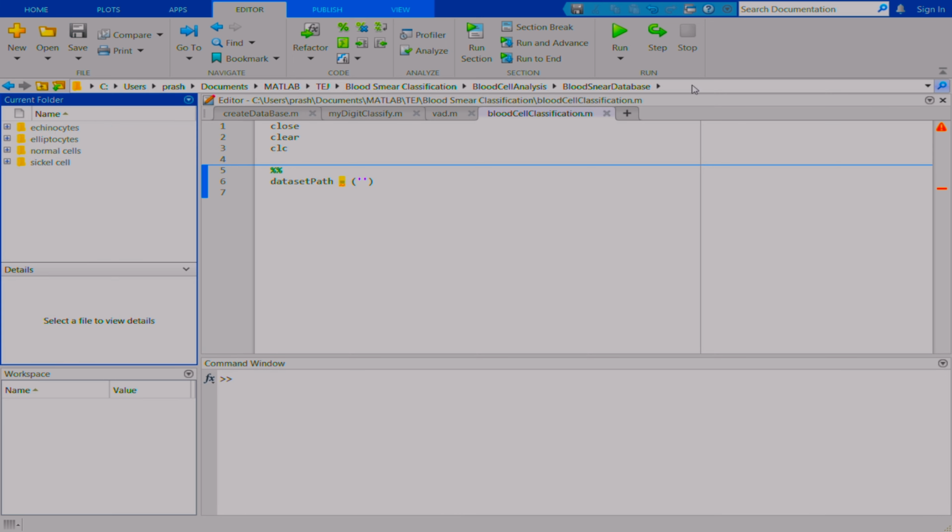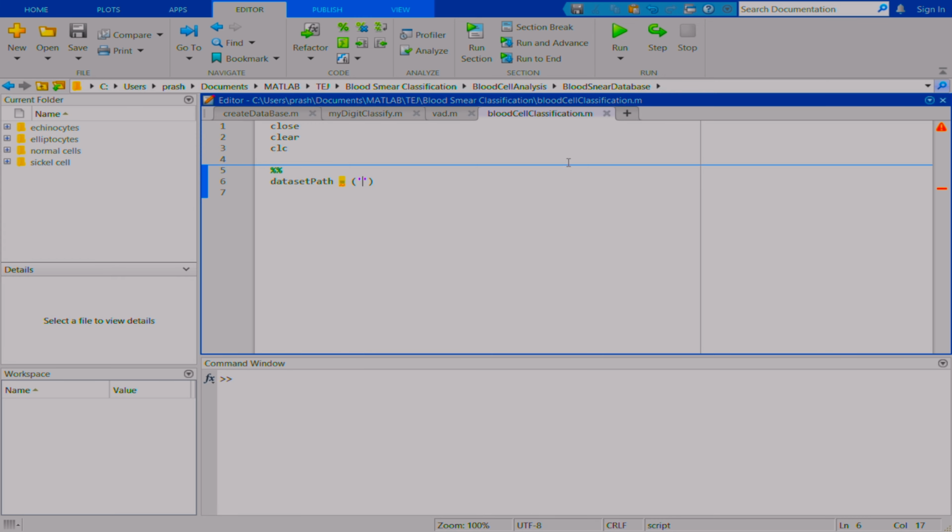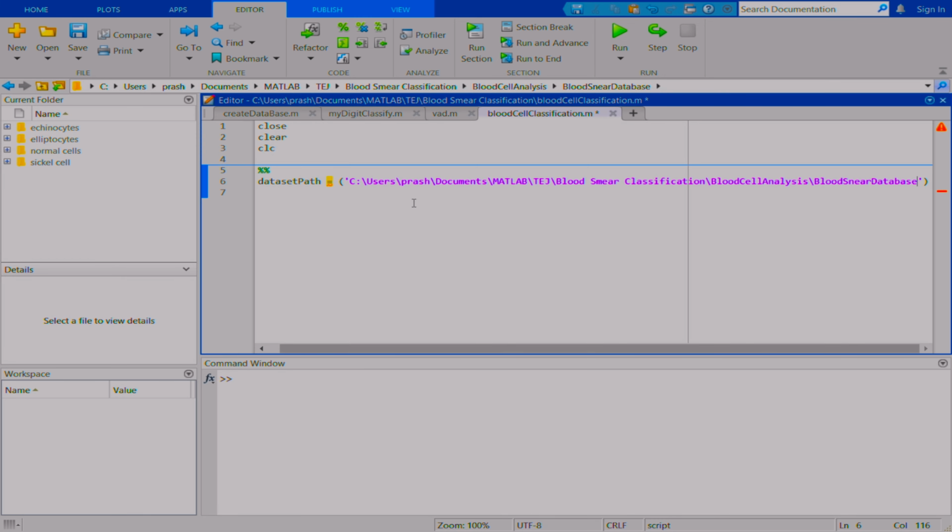Yeah, till here I need this. So don't go inside the four folders which contain the data set, but just tell me where you have the four different data sets. Four different classes, where are they located? Copy that and paste it over here as your database.